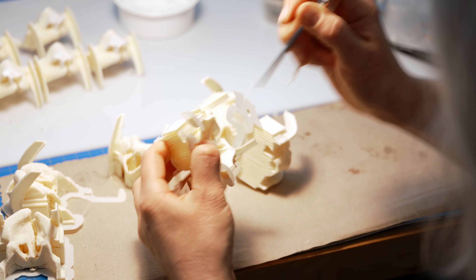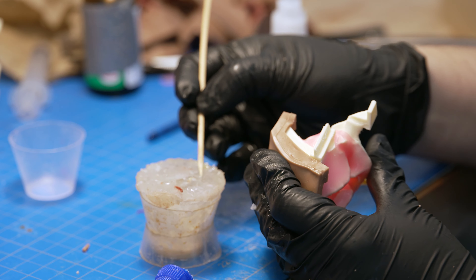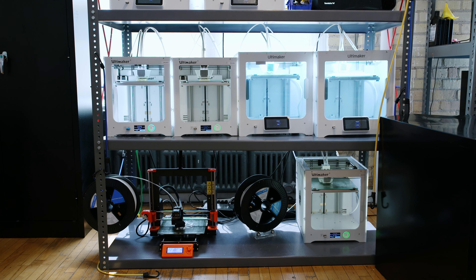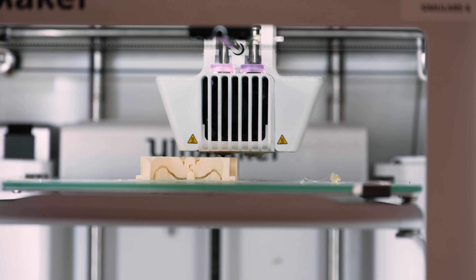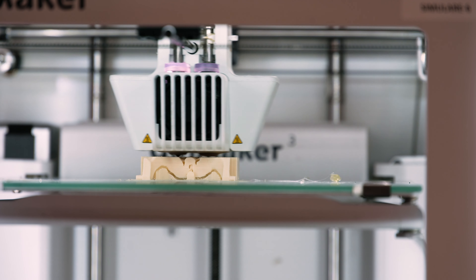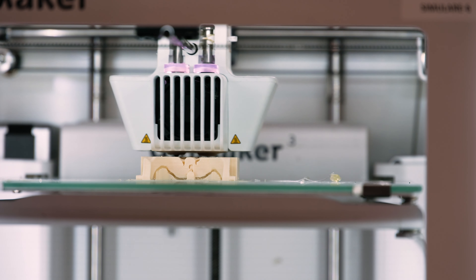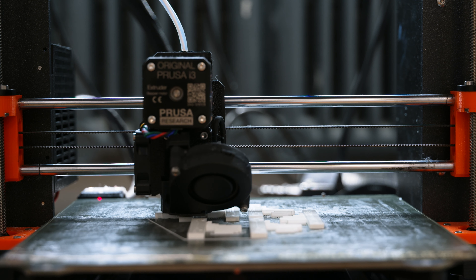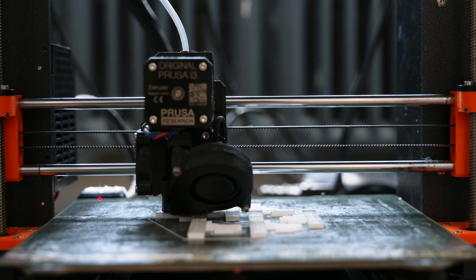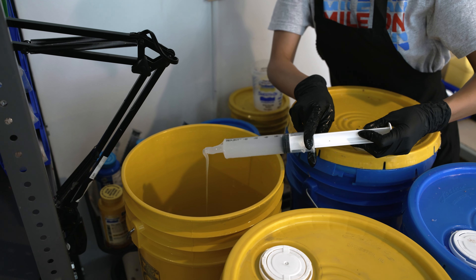Progressing to the muscles and additional soft tissue, the process begins with creating the bony material, which entails producing a hard and dense substance. In this case, we use plastic which is 3D printed using our array of 3D printers. Additionally, we print the molds which are used in the next manufacturing stage.